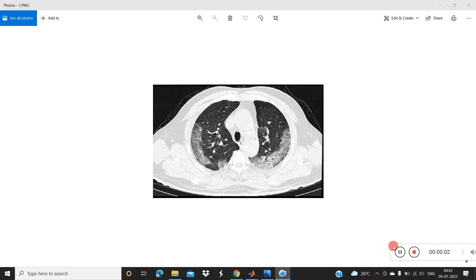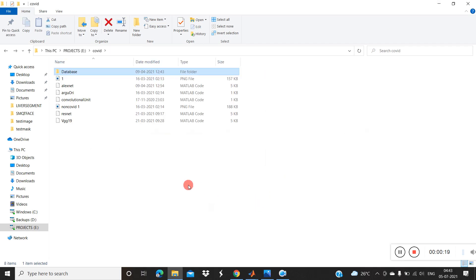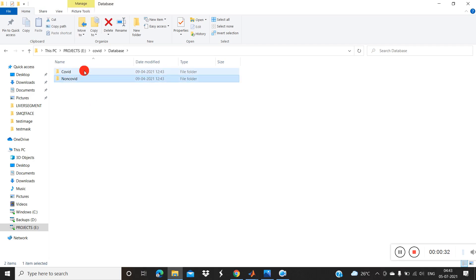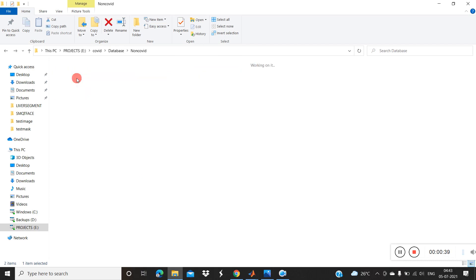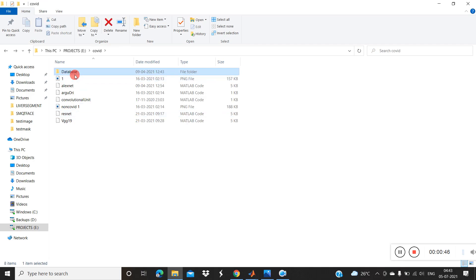Hi guys, today I'm going to show you how to classify COVID samples from lung CT images with the help of a convolutional neural network. First, create one folder and rename it as 'database'. Inside that folder, create two more folders and rename them as 'COVID' and 'non-COVID'. Collect the COVID images and keep them inside the COVID folder, and collect some non-COVID images and keep them inside the non-COVID folder.